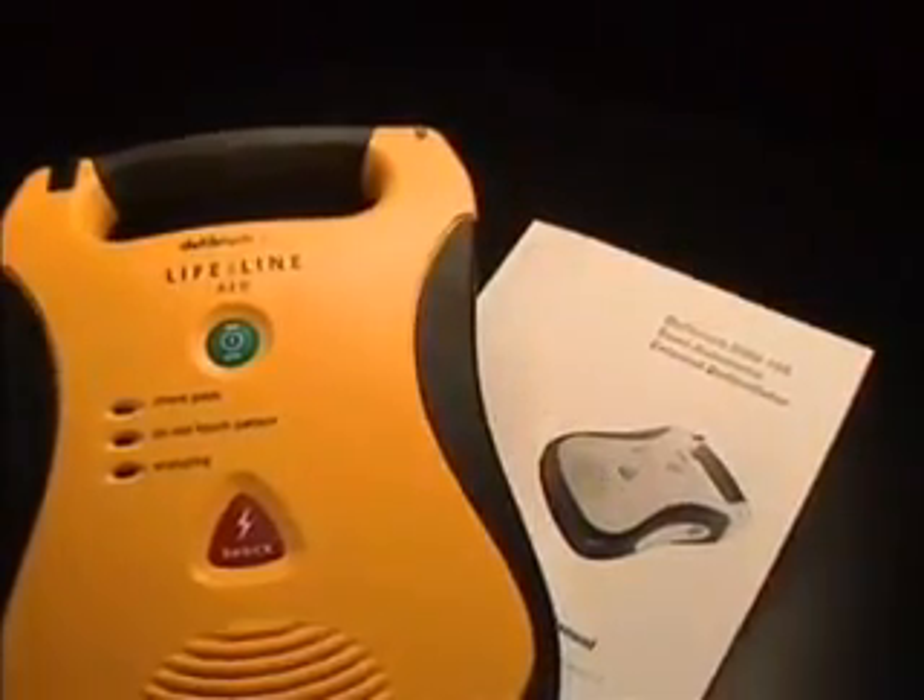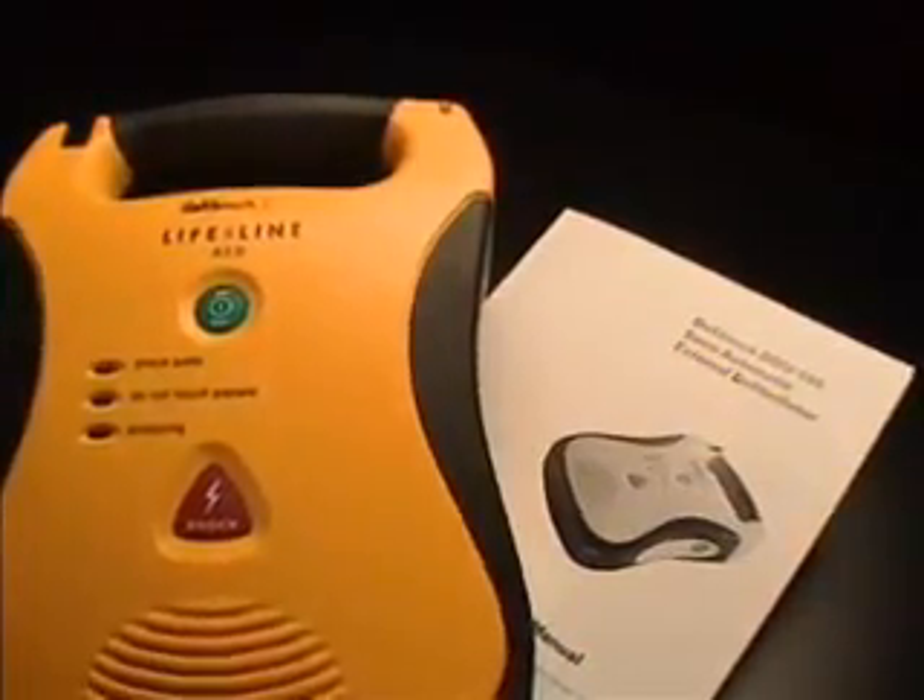For a complete discussion about the Lifeline AED, its voice prompts, and other related information, please carefully review the user's manual.